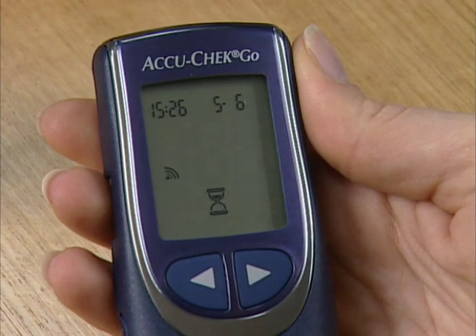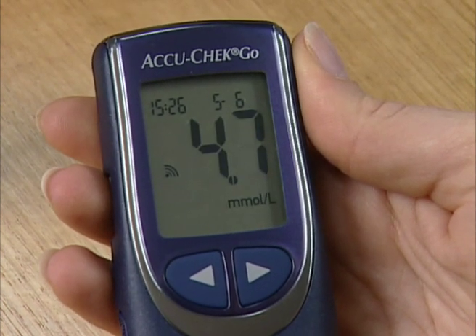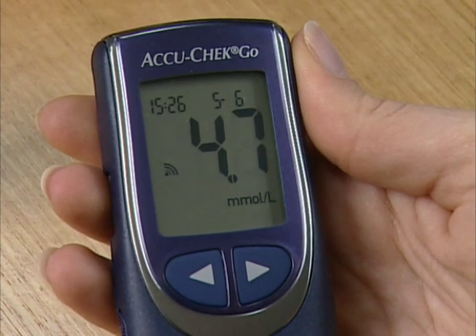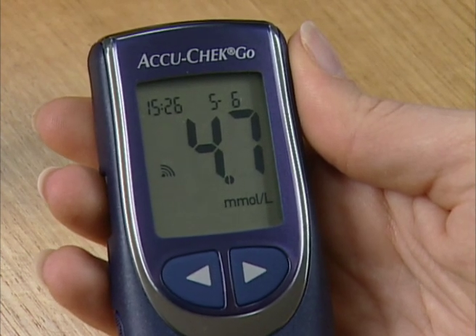An hourglass symbol will appear on the screen to show that testing is in progress. The result will be displayed on screen and the reading will automatically be saved with the time and date.